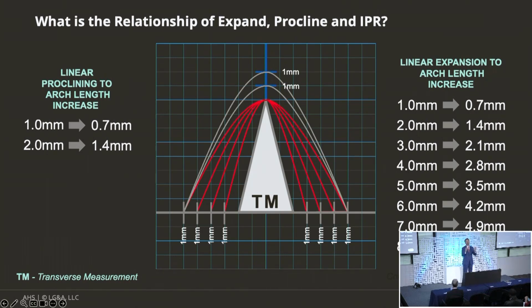This shows you exactly how little you need to do to reduce your IPR exposure. So now you can take a picture of this. It's going away, but you scribbled it on your pad, so you'll have a photo in your phone, and you'll have a picture to see that, oh, next time you open your treatment plan, you do your math on your treatment plan. So let's say the treatment plan comes back and it has 2.1 millimeters of IPR. You write back and you say, please expand away the IPR. That's an easy way to say it. Please expand away the IPR. And they'll move the teeth a little more and the IPR will disappear, basically giving me my tooth structure back. So that's a simple way to correct that, is just write back, please expand away the IPR.